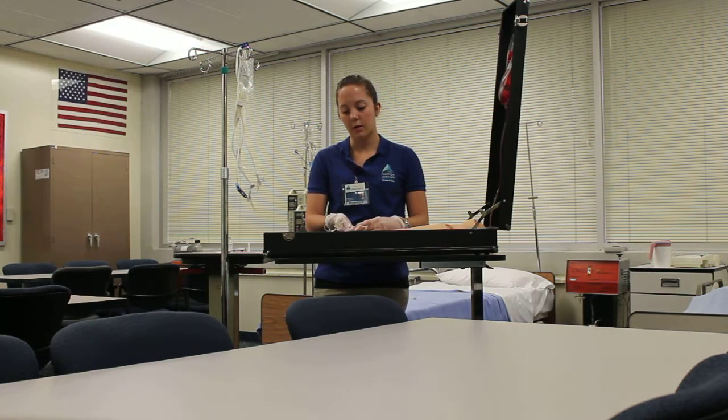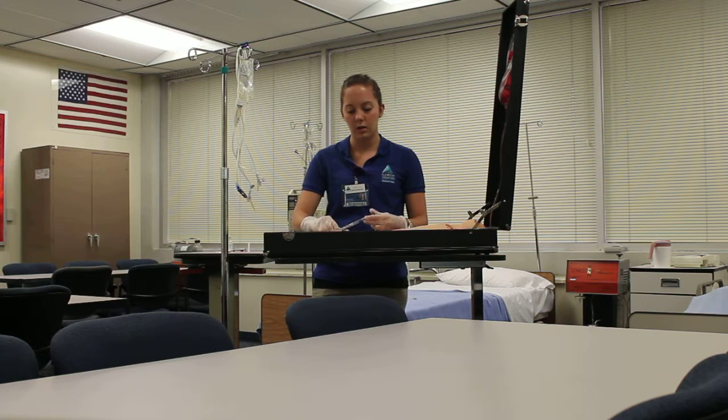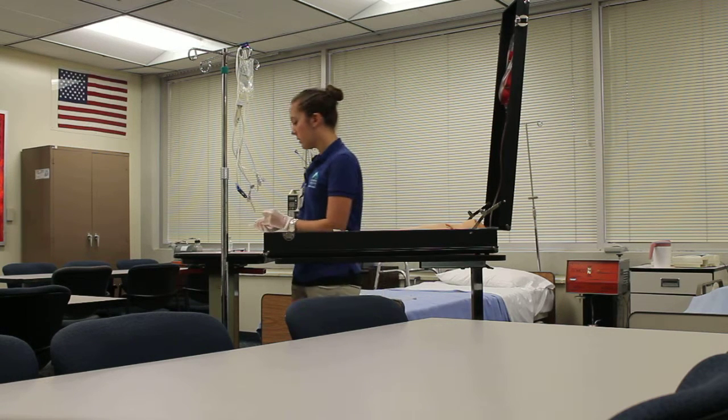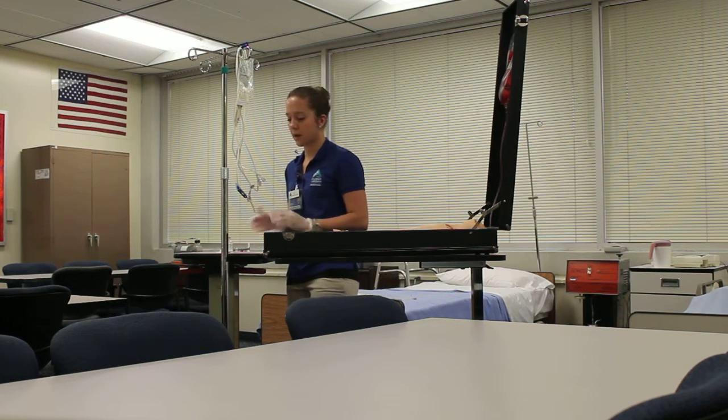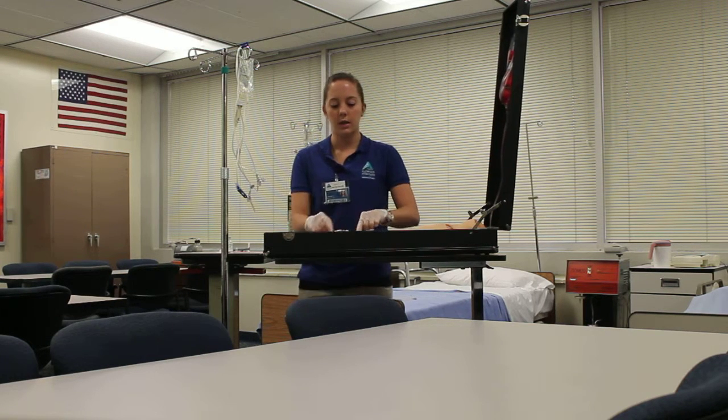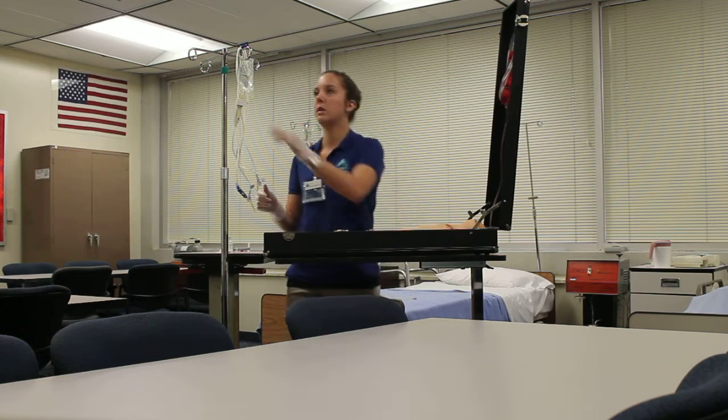So every half a ml that I push in the normal saline, I'm going to stop. And I'm going to continue to do this until I'm done. Once I've done that, I can disconnect the syringe to the side. So I've checked for patency, I've checked for phlebitis or infiltration. I can go ahead and hook up the IV.